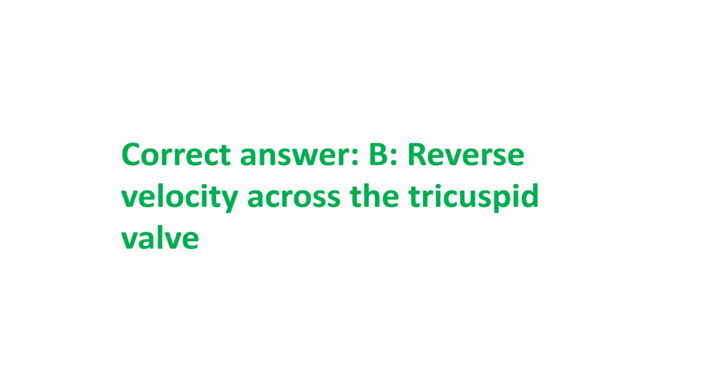The early diastolic pulmonary regurgitation (PR) gradient, the peak PR gradient, will give an estimate of mean pulmonary artery pressure. End diastolic gradient of PR will give an estimate of pulmonary artery end diastolic pressure. Ideally, the right ventricular end diastolic pressure has to be added to the end diastolic PR gradient to get the pulmonary artery diastolic pressure.